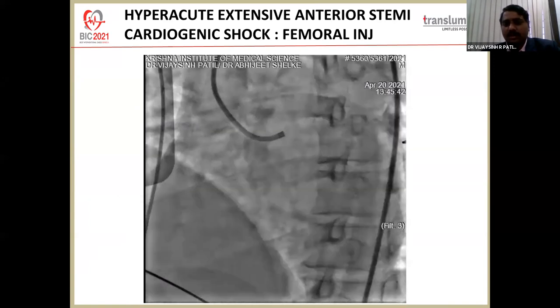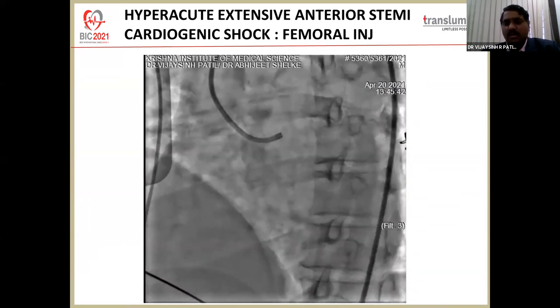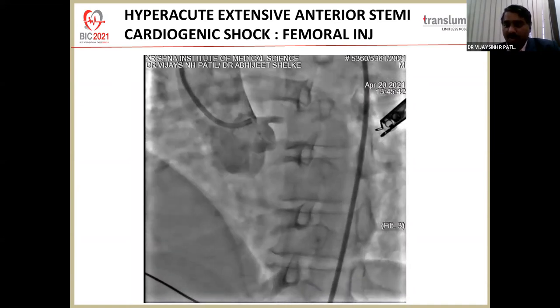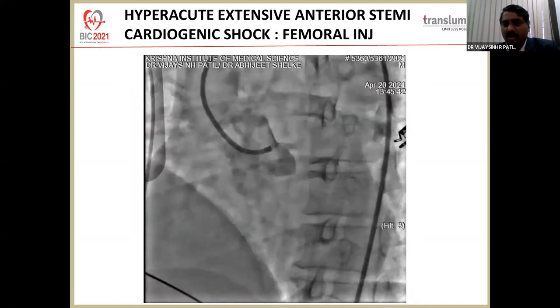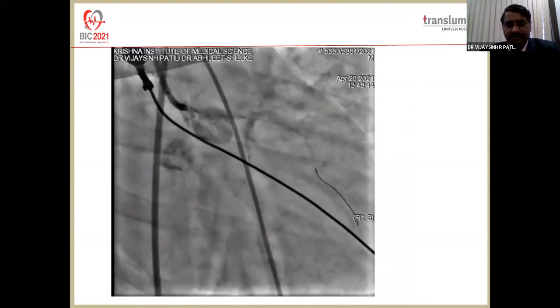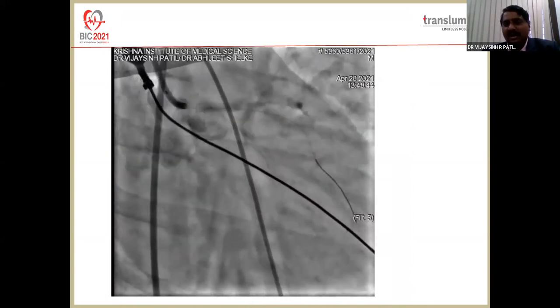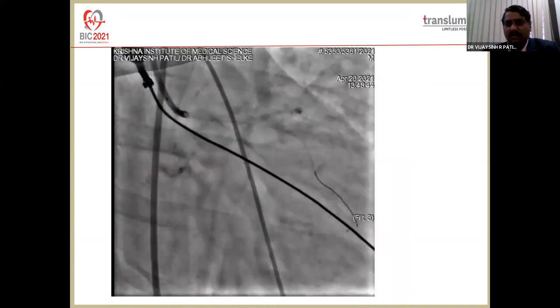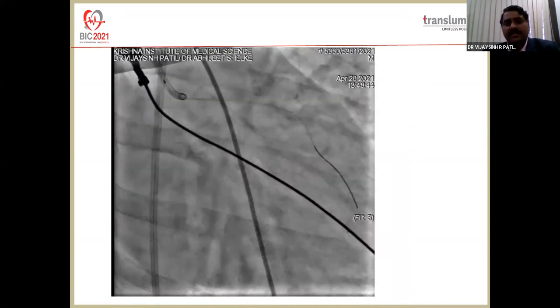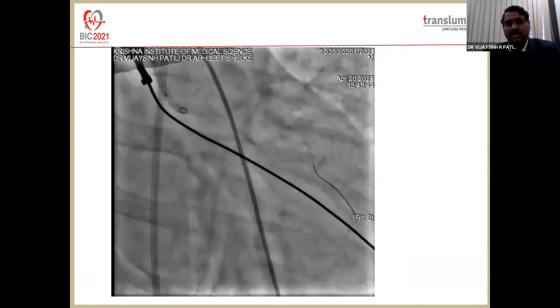And we thought it was a completely thrombotic occlusion, and the patient's blood pressure here was unrecordable. We had a very limited amount of time to take a decision. So in that hurry, one operator was ordered to start a balloon pump from the contralateral side while we started wiring this lesion with a balloon already on the wire. Wherever the wire went, it actually saved the patient's crash, and it dislodged a bit of thrombus. With the wire itself, we could see some sluggish flow in both the circ and the LAD. And we could see there was a tight distal left main stenosis, and probably it was an atherosclerotic stenosis.